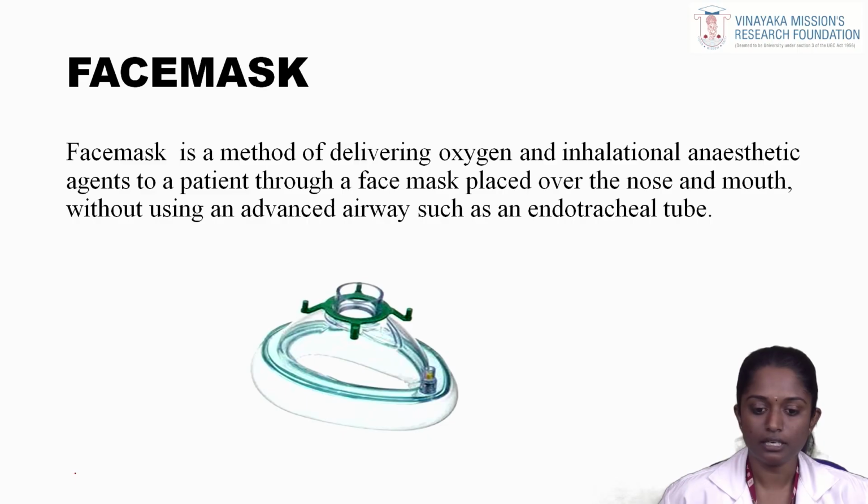So first we will be seeing about the face mask. What is a face mask? It is a method of delivering oxygen and inhalational anesthetic agent to the patient through a face mask that is placed on the nose and mouth. Without using an advanced airway like an endotracheal tube, we are just placing a face mask which allows us to give oxygen and inhalational anesthetic gases to the patient.